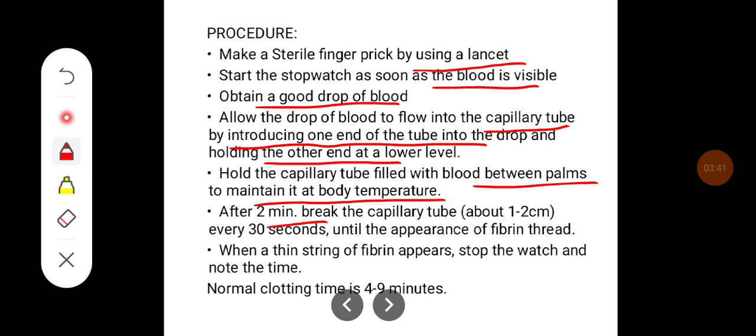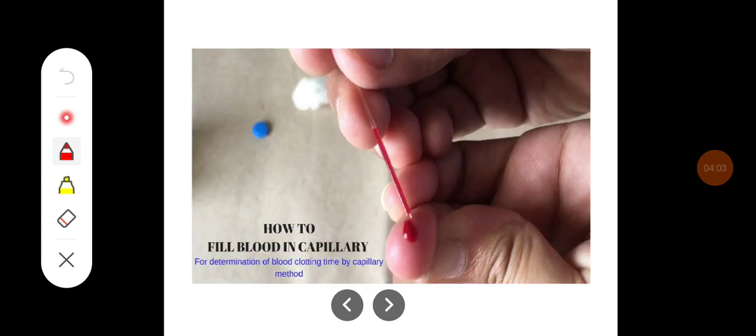After two minutes, break the capillary tube about 1 to 2 centimeters every 30 seconds until the appearance of the fibrin thread. When a thin string of fibrin appears, stop the watch and note the time. That will be the clotting time. The normal clotting time is 4 to 9 minutes.